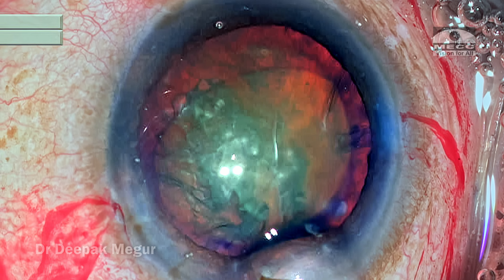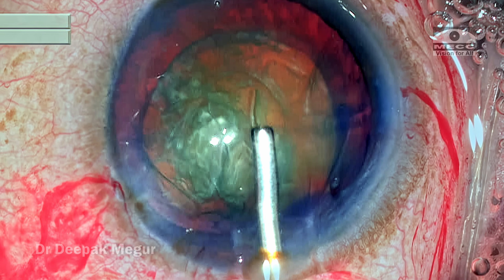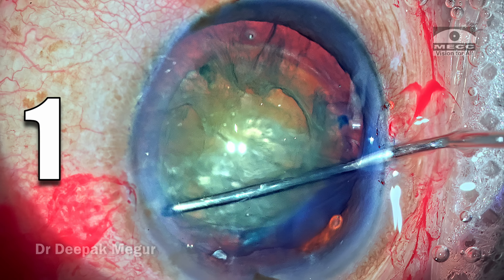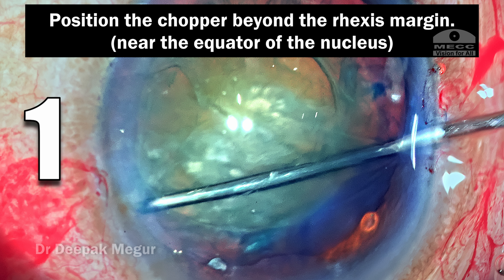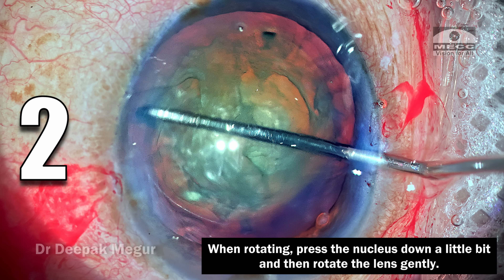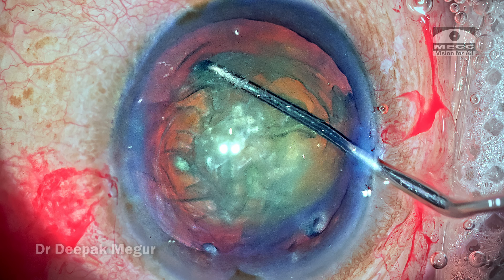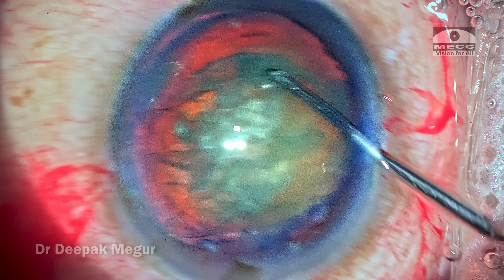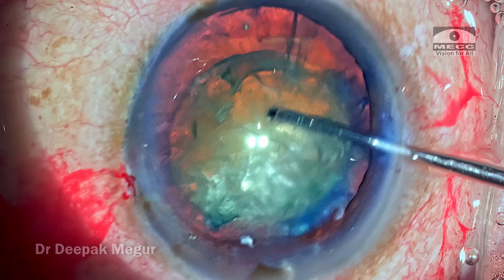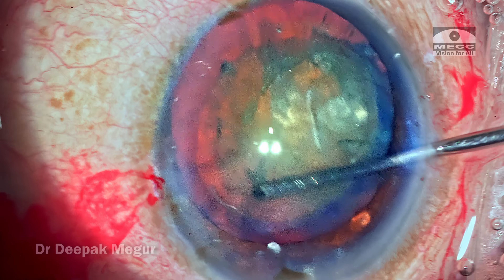Looks better. I reinflate the chamber with OVD before rotating the nucleus. Two important tips here: number one, position the chopper beyond the rhexis margin near the equator of the nucleus to get a better torque effect, requiring less physical force. Number two, press the nucleus down slightly before rotating. These two factors ensure we're not imparting stress on the already compromised zonules. The nucleus is gently rotated a couple of times — reassuring that it's alright to proceed.